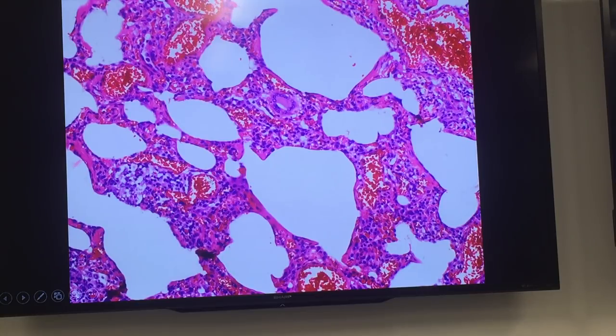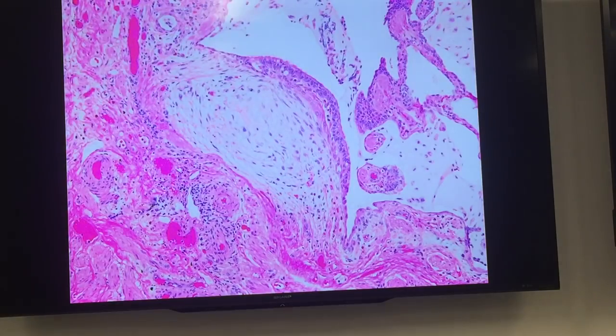Let's assume that's not a granuloma, but still your interpretation holds true, right? What if I remove the giant cell? Then what would this be? Still hypersensitivity pneumonitis? Could be. NSIP. NSIP, sure. Yes, the cellular variant of NSIP would be your differential, right? So that giant cell then becomes like a key finding in this situation. All right, let's go to the next one.